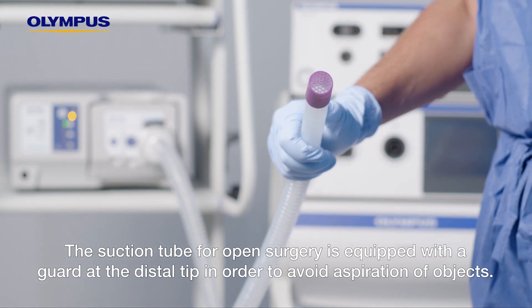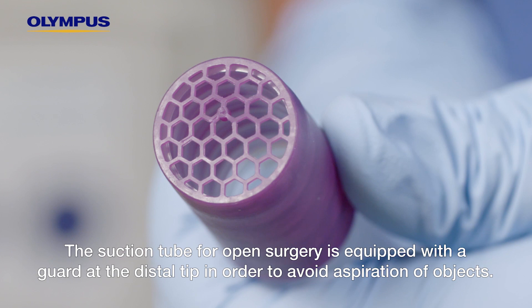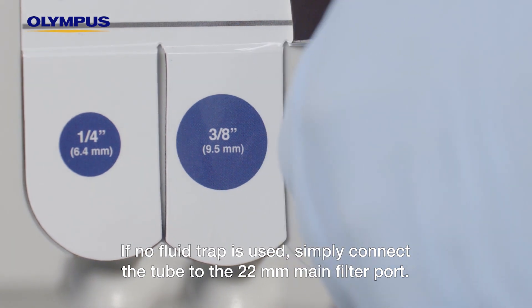The suction tube for open surgery is equipped with a guard at the distal tip in order to avoid aspiration of objects. If no fluid trap is used, simply connect the tube to the 22 millimeter main filter port.